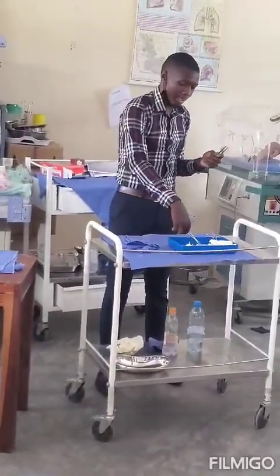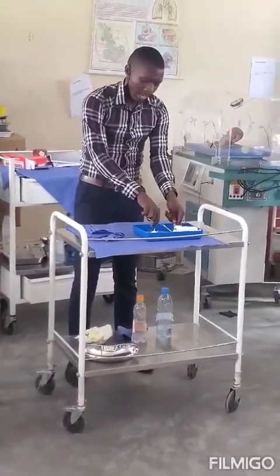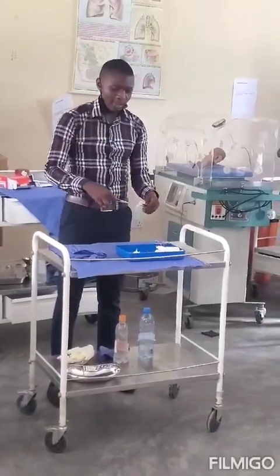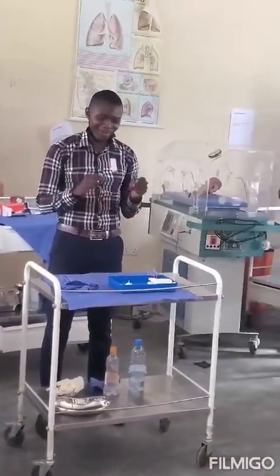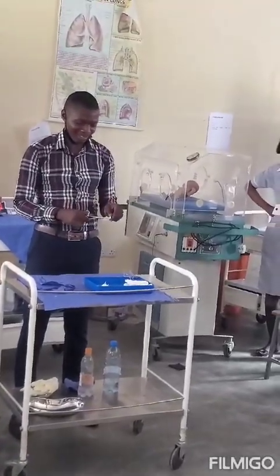So you need to pick them. Make sure you pick, get the suture and you pin it to one of these forceps. Even with that, you are shaking, make sure you don't drop this but open it and make sure you put it somewhere.